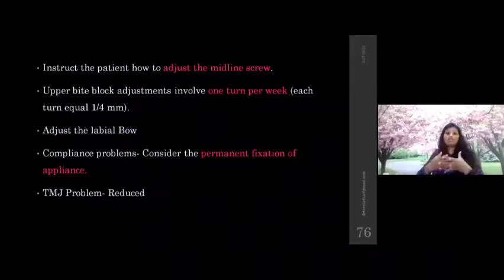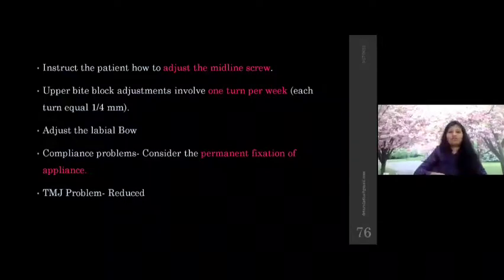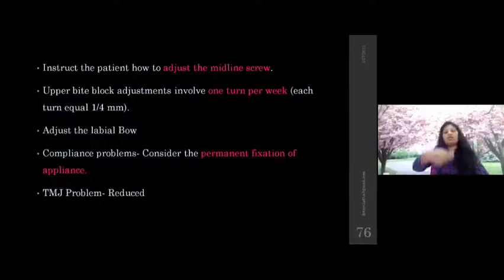How do you activate the midline screw? There will be an arrow inside. If you have seen the slide, there is an arrow inside the expansion screw. That arrow tells you the direction of turning of your screw. In a growing child, what we usually suggest is 1 turn per week, and give this instruction clearly to them and to the elders also, so that they can help him in opening this appliance and making him wear it properly.